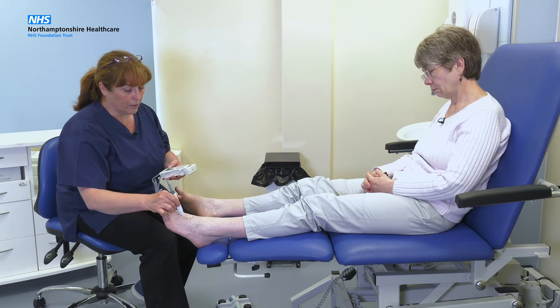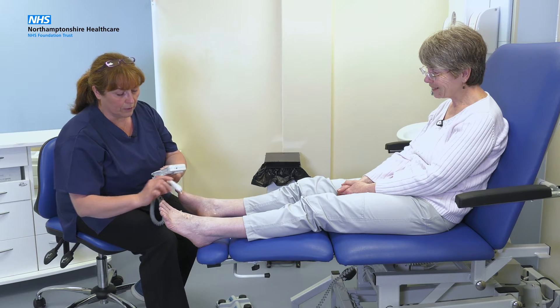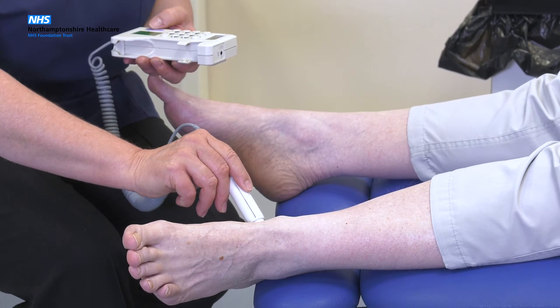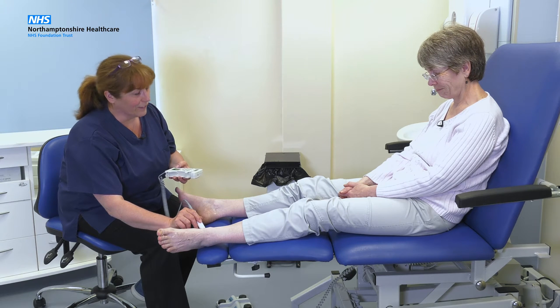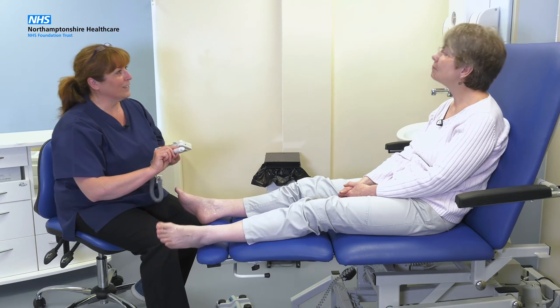That's a nice healthy sound. Things are not always where we think they're going to be — sometimes you have to hunt for them a little bit. [Doppler applied to second pulse.] And again, a nice healthy sound. So that's your vascular test finished. Thank you very much.